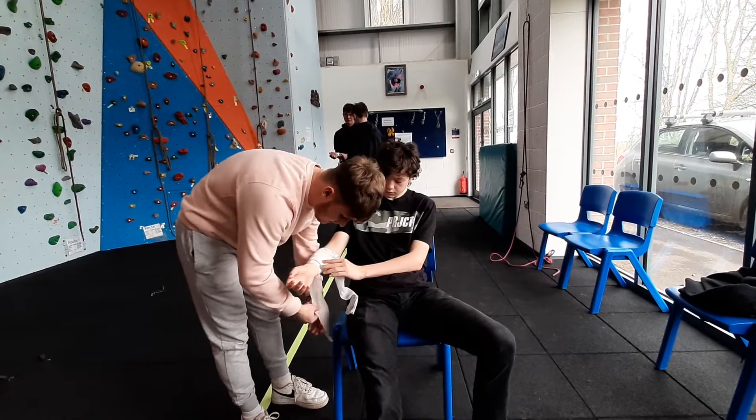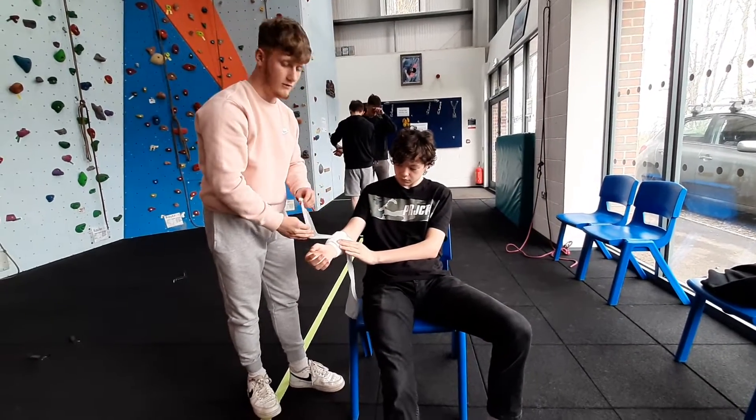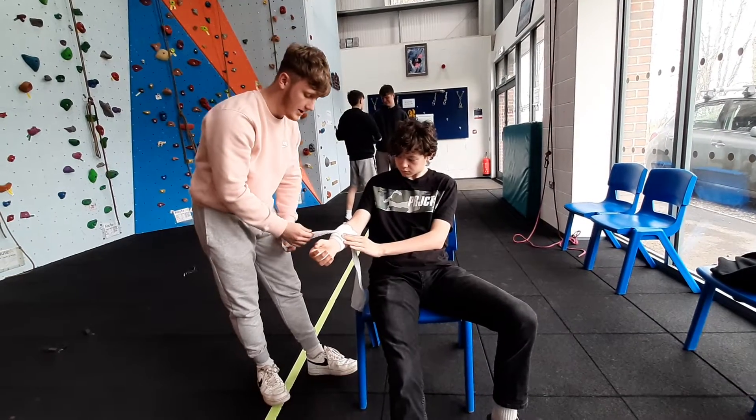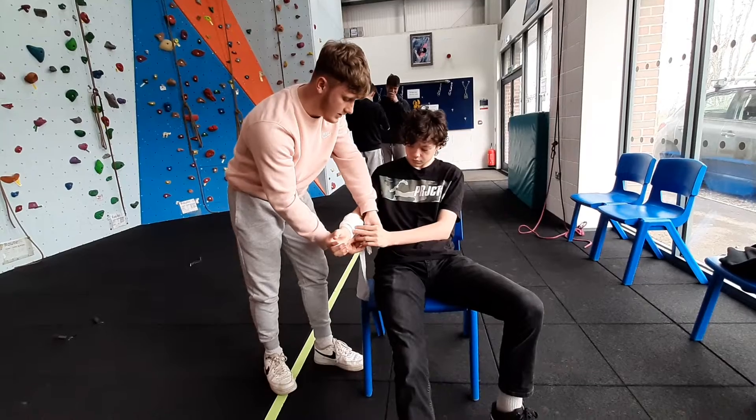You want to make sure that the bandage doesn't tangle or knot up. This is so it doesn't affect the overall effectiveness of the bandage, which could cause further harm to the injury.